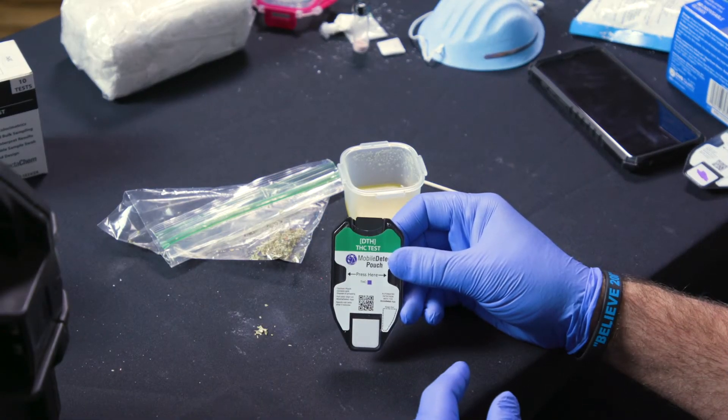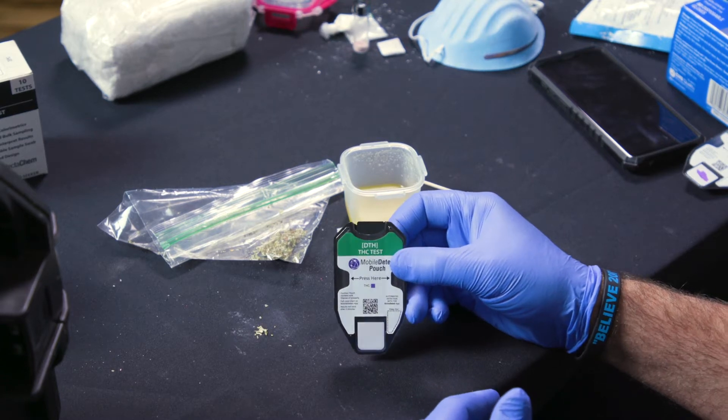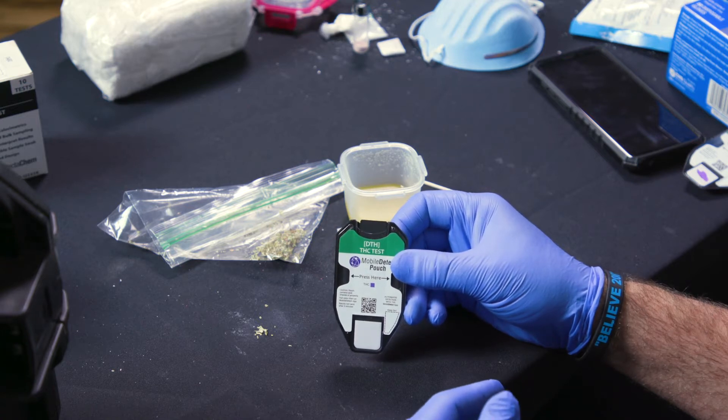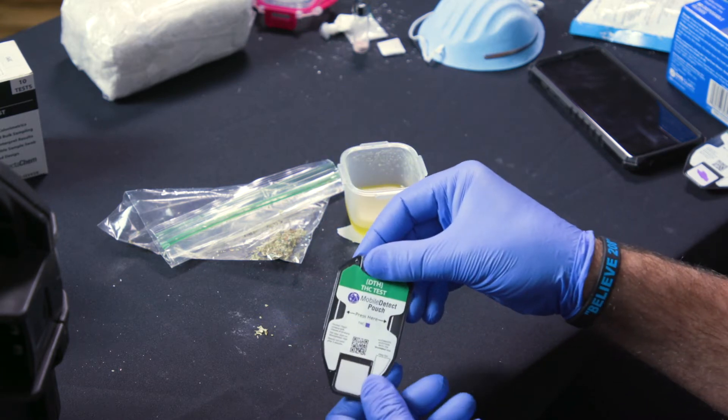The THC pouch is a multi-stage process for detection of not just marijuana, but edibles, BHO, vape oil, many different things. So what we're going to do — we'll use the example of standard plant material marijuana.